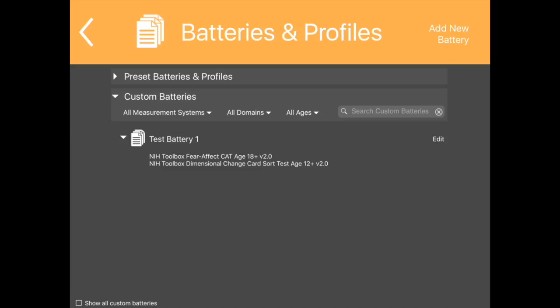If a battery has been created but is not desired in the list of custom batteries, the entry can be archived. This may be useful in managing data after testing, training, or practice. If a battery is created in error, the Archive function allows the user to remove it from the visible list. Batteries can be archived or unarchived at any time.